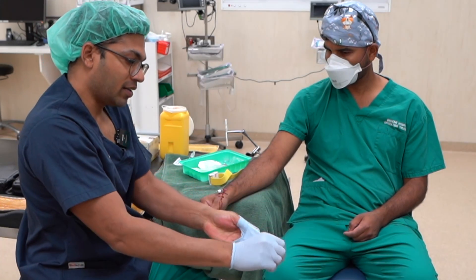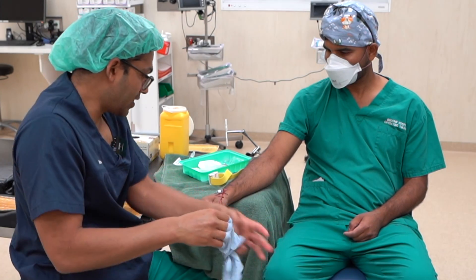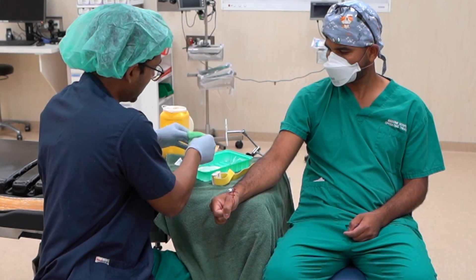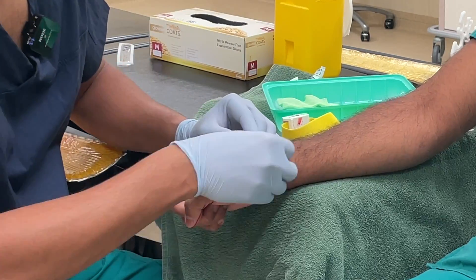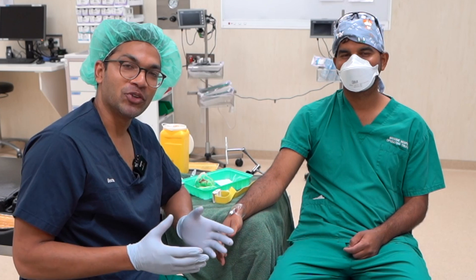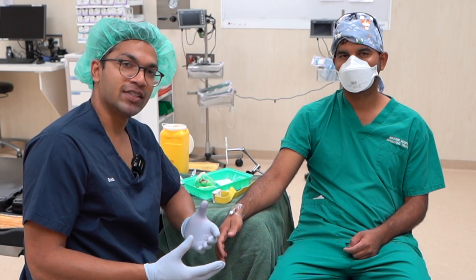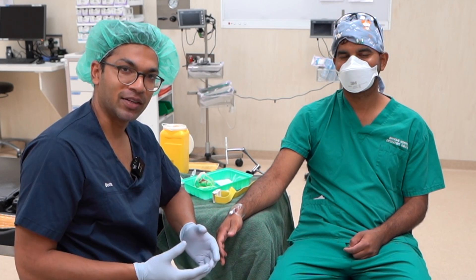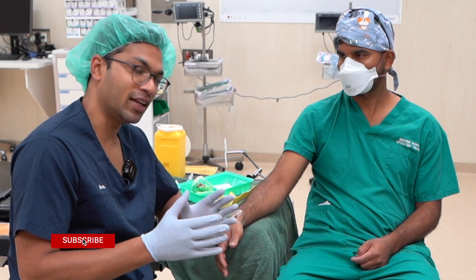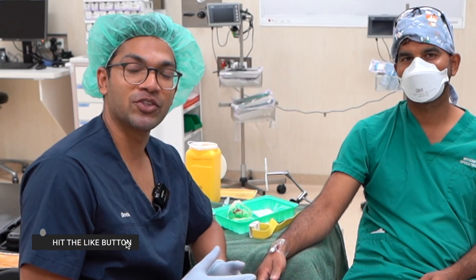Because my gloves have blood on them, I take those off and put on a set of clean gloves so I can clean the area and dress it appropriately. And there we have it — a successful cannulation! I really hope you enjoyed this video and learned something about the differences and things to watch out for in a dark skinned patient, and also what to do if something goes wrong — keep all your principles right, don't panic, and sort the problem out in a measured way. Please share with anyone who might be interested.